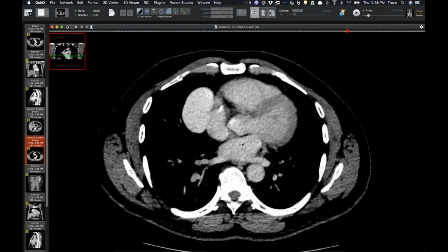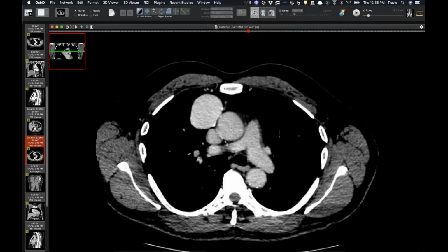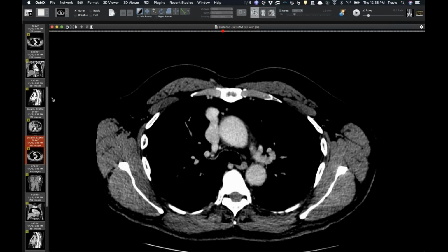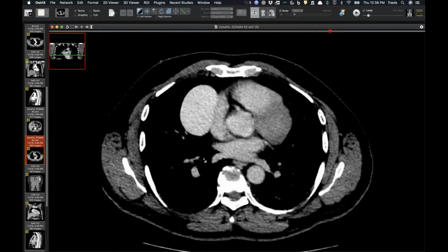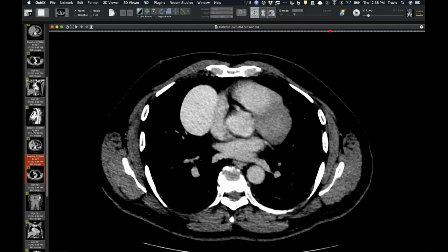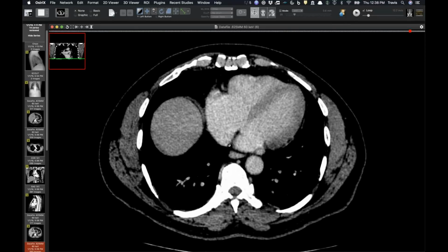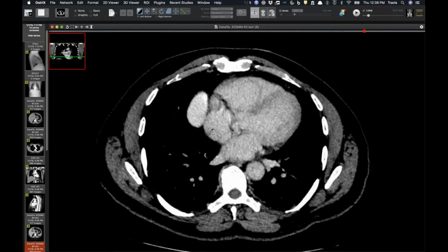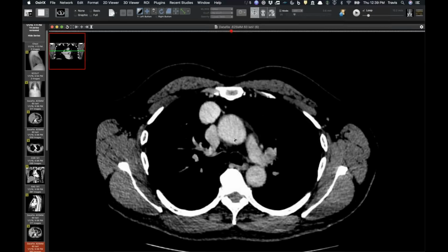Yeah, I know. It was funny, though, because my first year resident, the first thing that was said when we were talking about differential, she said that you can see aneurysms of the SVC, which was kind of funny. And it turns out she was right, but I told her never include that in the differential again on the radiograph alone, since this is the first and only one I've ever seen. But, well, she may be a first-year resident, but she's 103 years old, so she's seen a lot.